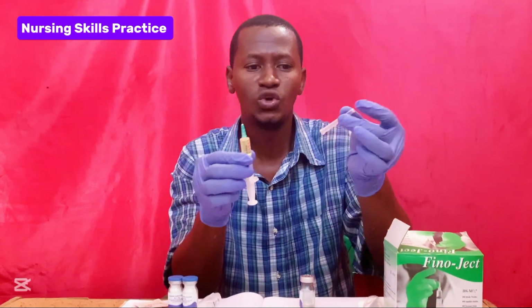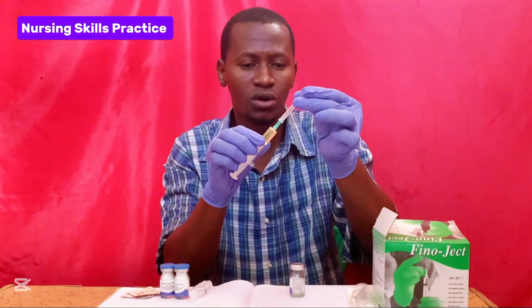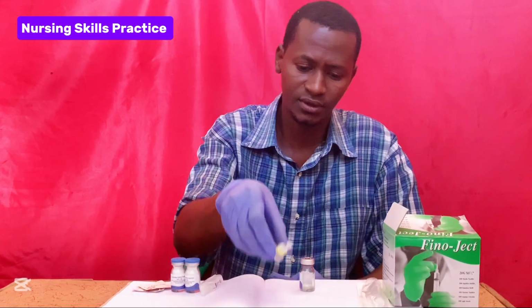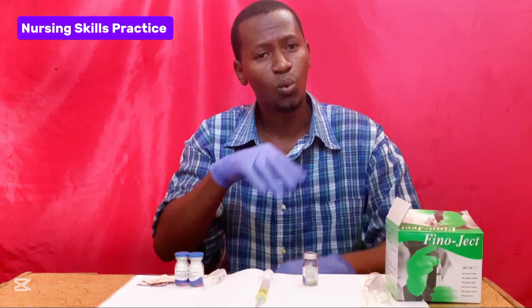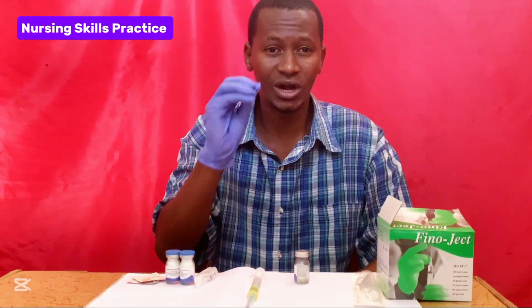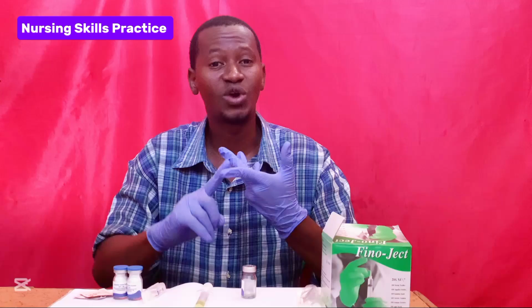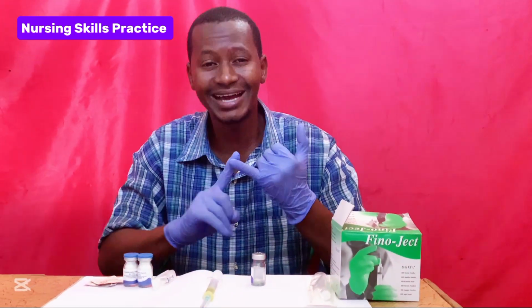Then you put back the cap of the needle to ensure sterility of the drug and avoid contamination. Once you have reconstituted, you should administer the drug to the patient immediately. Before you administer, follow the guidelines of drug administration: right patient, right drug, right dose, right route, right time, right reason, and the right documentation.